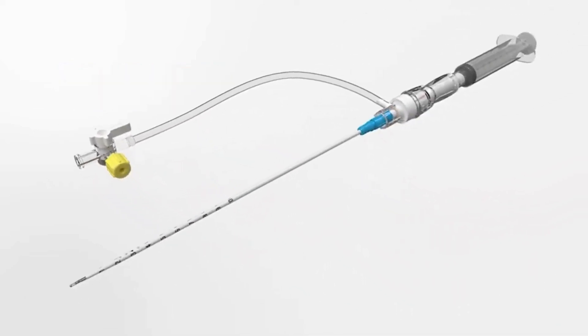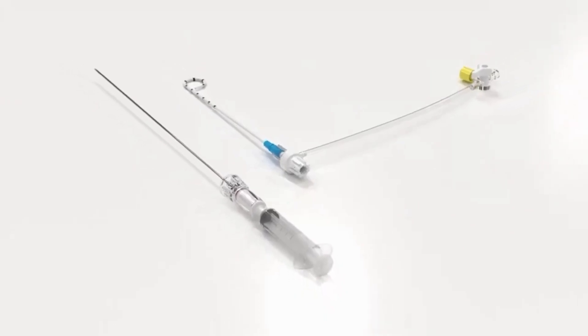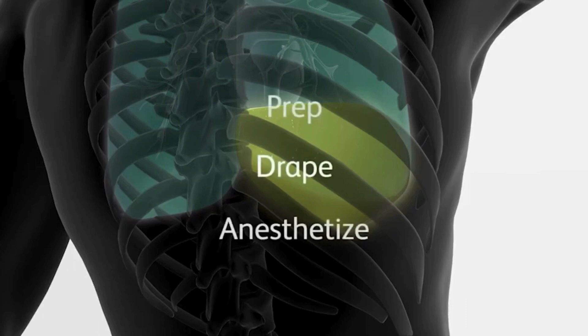Please be sure to review the instructions for use prior to using the device. The Safety Centesis device is delivered disassembled and consists of a catheter drainage assembly and safety introducer needle. Once the location of the effusion has been identified, prep, drape, and anesthetize the patient.